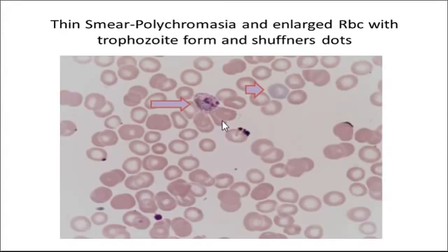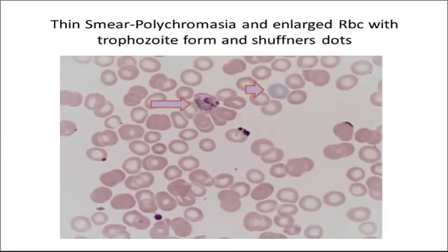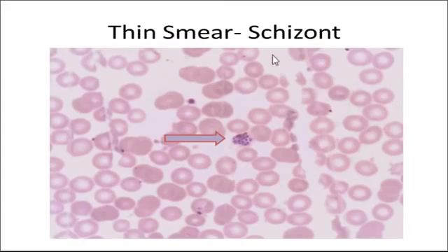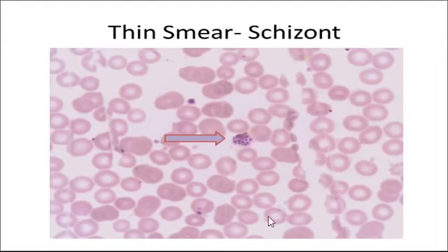In the infected RBC, we can see numerous tiny dots known as Schüffner's dots. You can also see the chromatin dot, slightly enlarged, and the bluish-gray cytoplasm of the parasite, which has increased from the ring stage to a larger, more developed form. Normoblasts can also be seen, signifying increased bone marrow RBC production in response to destruction by the parasite. In this schizont, you can make out the multiple merozoites — as noted, 12 to 24 merozoites per schizont.